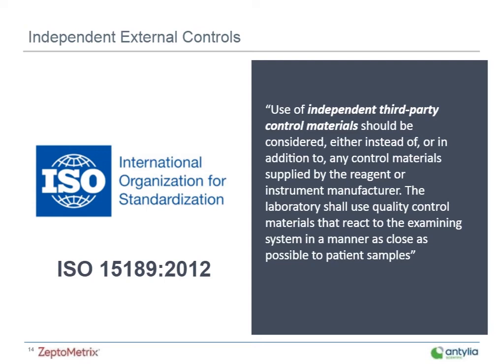Obviously, the availability of molecular diagnostic tests is booming right now, but considering we didn't even have PCR until the late 1980s, it is still quite a young field. And I think it's the hope that independent quality control materials will bring molecular infectious disease testing to the level of standardization and uniformity that's needed in clinical testing.